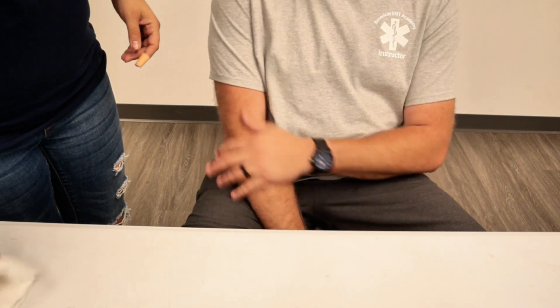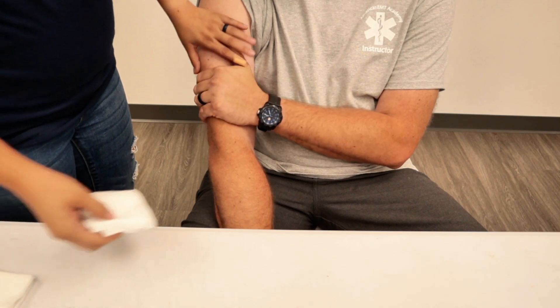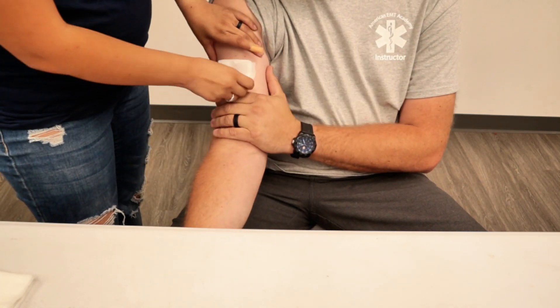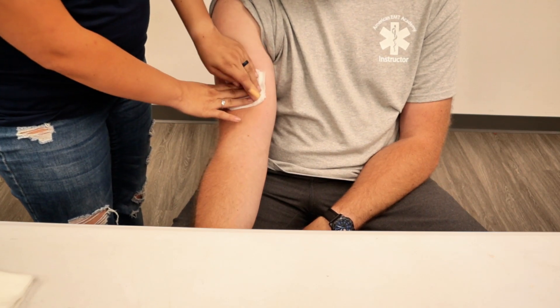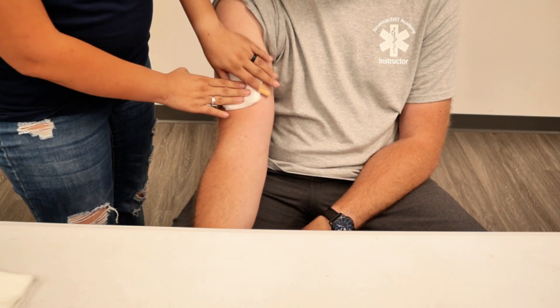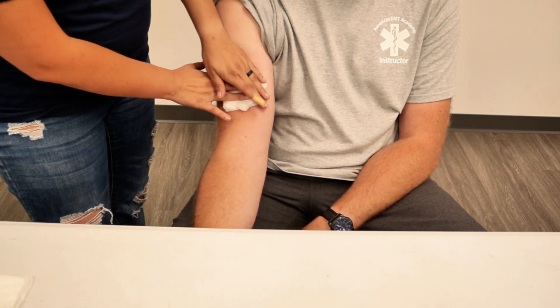The patient in this case is going to have a significantly bleeding wound from the arm. The first thing we're always going to do is apply direct pressure and hold that. If it bleeds through the gauze, we're going to take more and layer on top. We're never going to take it off — we're just going to keep going.